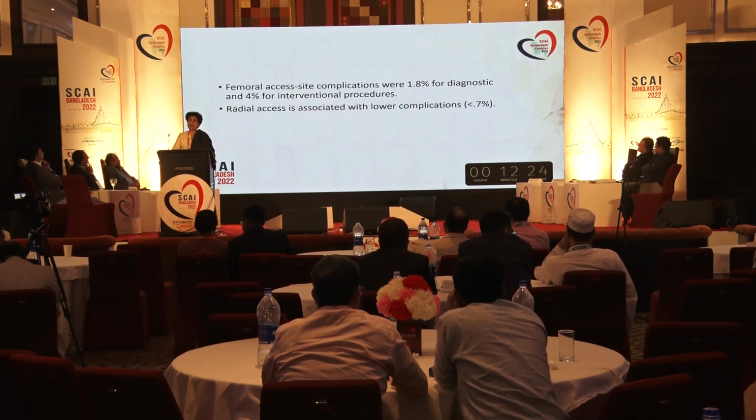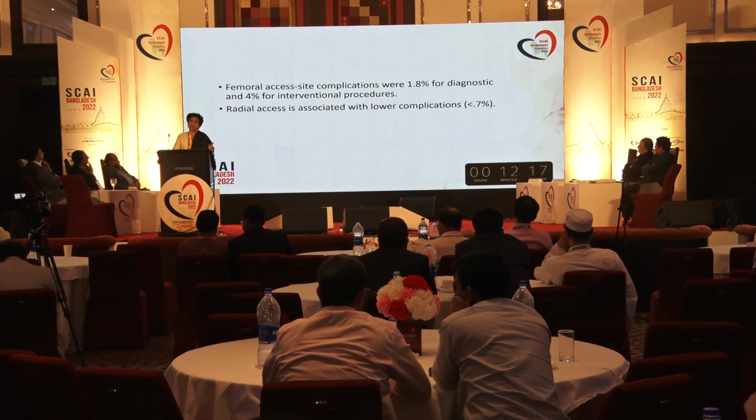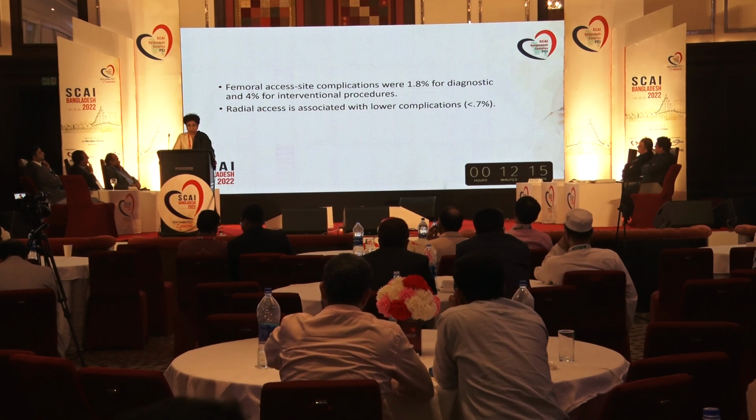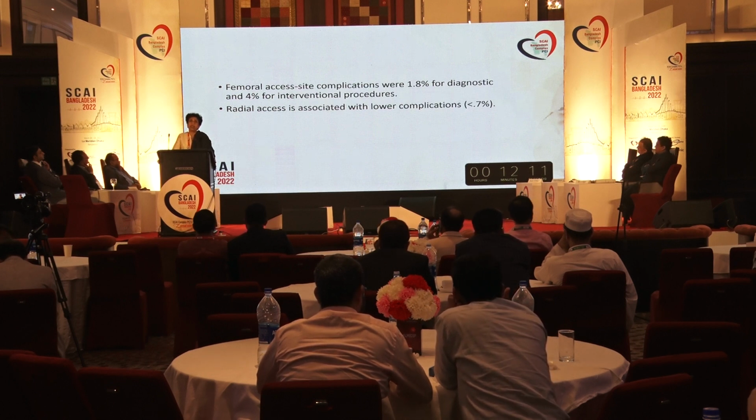So why did this happen? Well, obviously, femoral complications can happen, but maybe this was too high a puncture. So femoral access had complications overall.